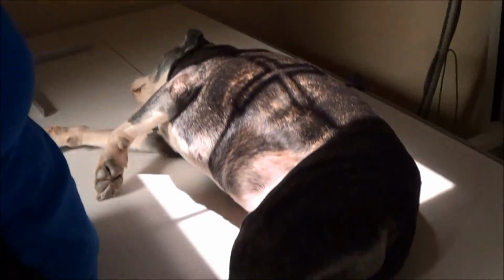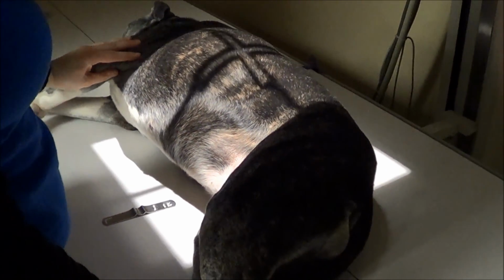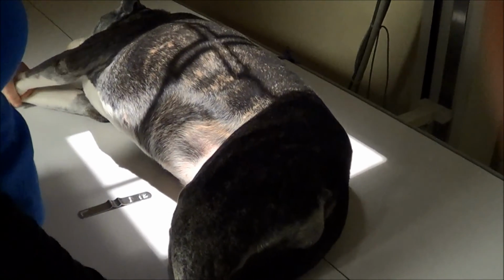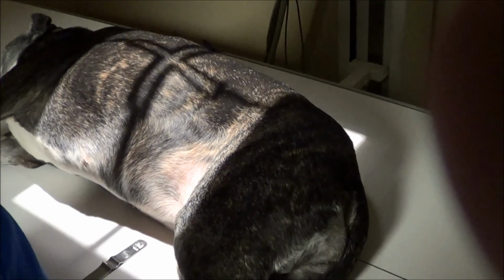You want to make sure the crosshairs are at the last rib, just where you measured, to make sure you get everything in the abdomen. Make sure your marker is in there, either the left or the right. And once you get them in position, you want to collimate down to reduce as much scatter radiation as you can.